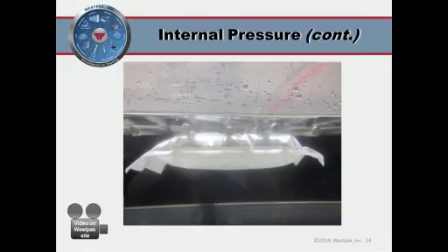So before I explain the difference between them, here's a picture of a porous package. As I mentioned before, a porous package is one side with Tyvek or paper. It is, like Herb mentioned, submerged in water, and you blow air into it looking for streaming bubbles coming out of it. There is a video on our website that will show you what it looks like. So going back to the question from the audience, when you do bubble testing, you detect any gross leaks and channel leaks like Herb mentioned before. So it looks at the whole package.